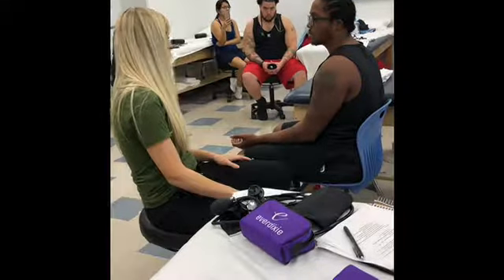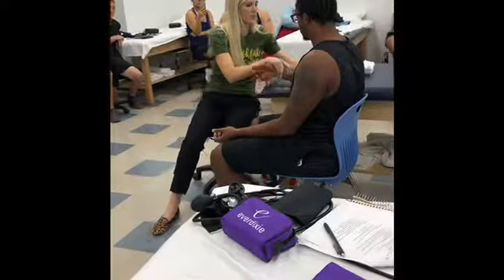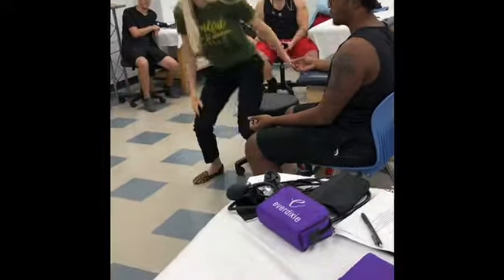All right, Q, lastly, we're going to check your blood pressure. Since you have a wound on this arm, we're going to check it on this right arm for you. You're just going to lay it there and relax. I'm going to grab the blood pressure cuff.